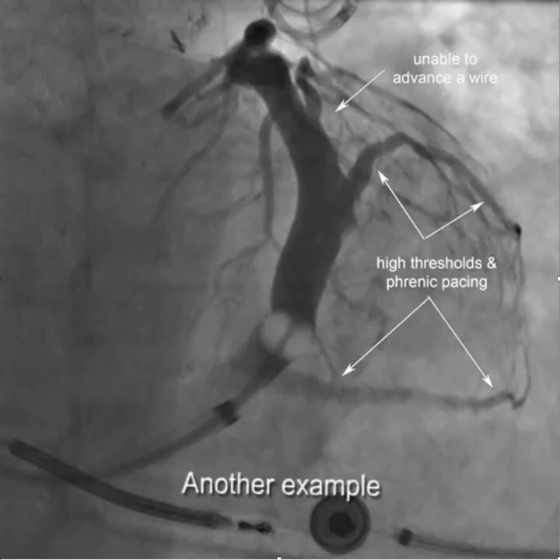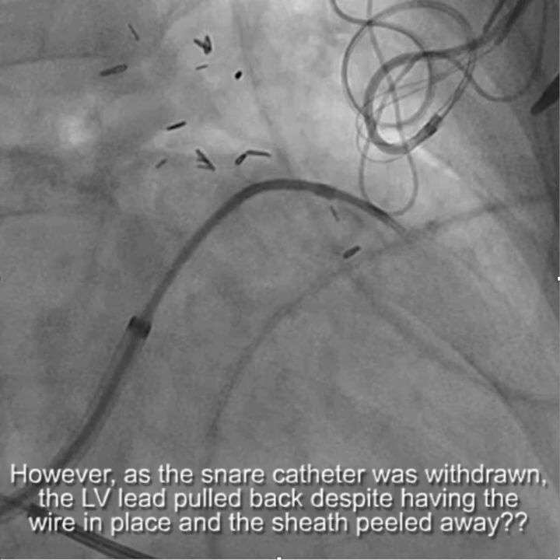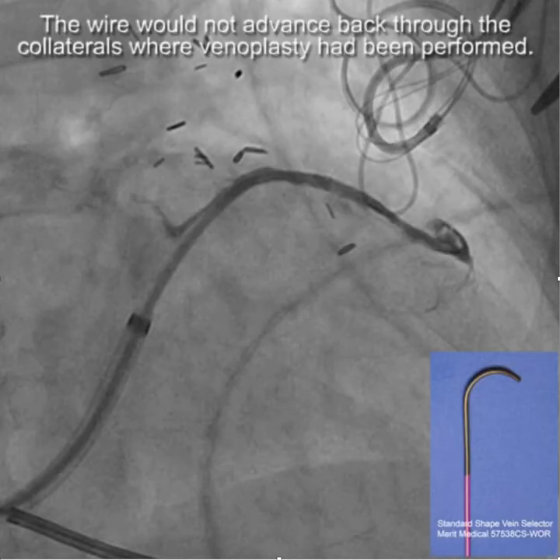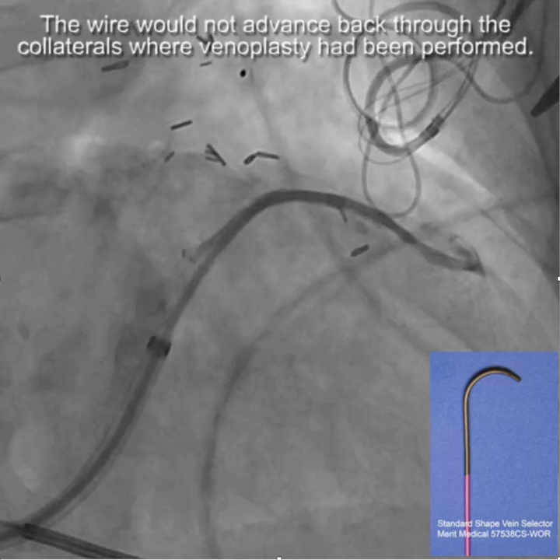This is just another example. There were high thresholds and phrenic pacing here, and then high thresholds all along there. We had successfully got the wire around, but somehow it got pulled back — we can always blame the fellows. Trying to get the wire back after you've done venoplasty is frequently very difficult; things are all torn up in there.